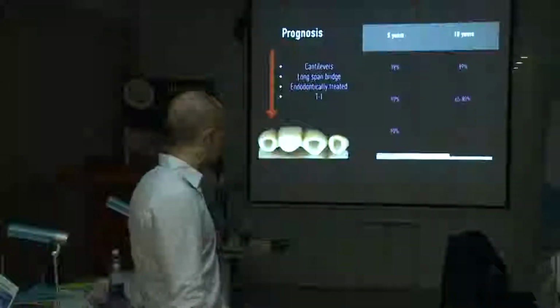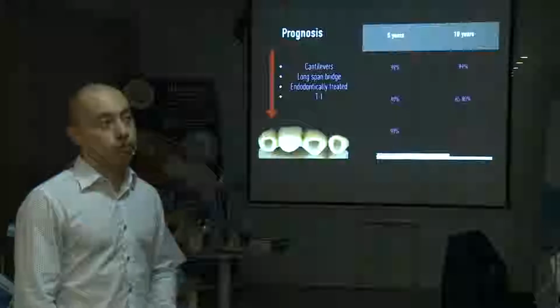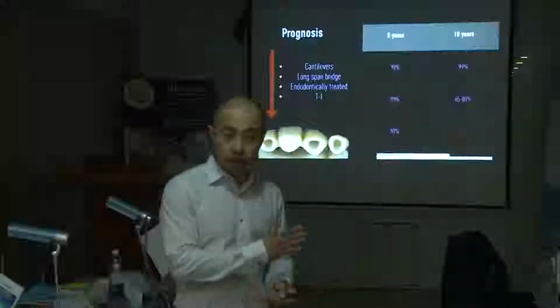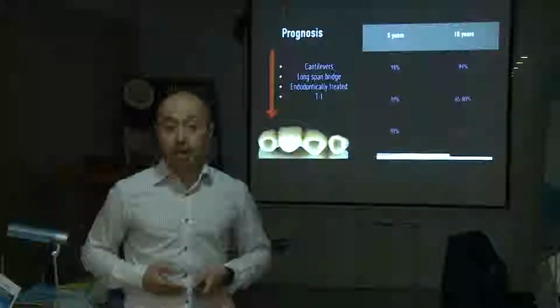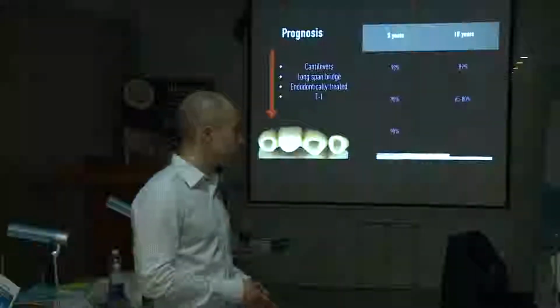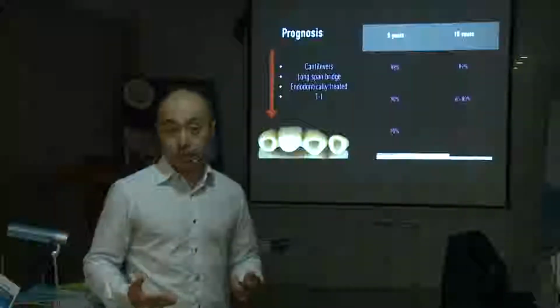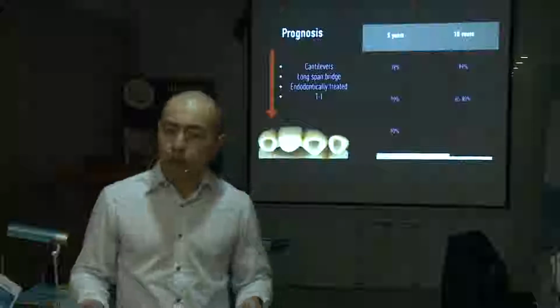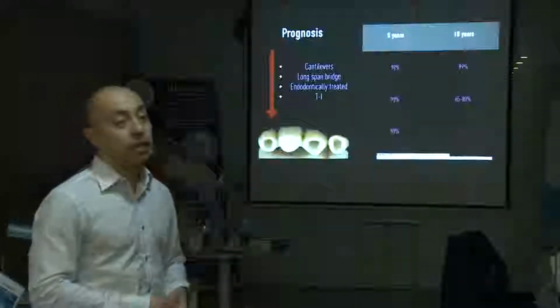So that's why I tell my patients, every patient between 20 years old and 60 years old, I say implants is the best solution I have to give to you. Cho nên đối với bệnh nhân trong khoảng tuổi từ 20 tới 60, thì ông luôn nói với bệnh nhân là giải pháp implant là tốt nhất. So only the elderly patients who already much of the time don't have nice teeth anymore, I say, okay, perhaps for you it's better to make a bridge. It's easier, quicker, no surgery for you. In those patients, I say perhaps we go better with the bridge. But the majority of my patients, I say implants are the best solution for you for now and also in the long term, on 10 years.